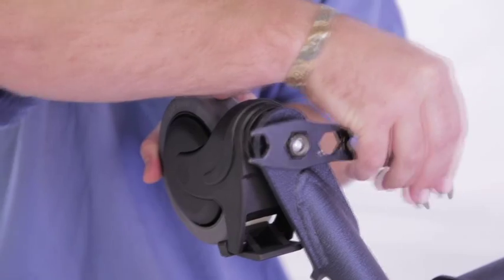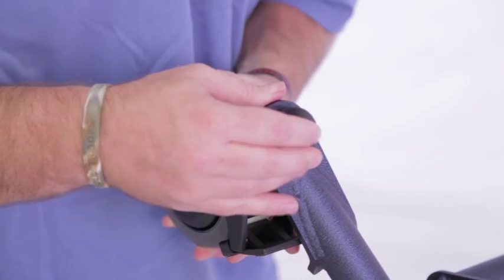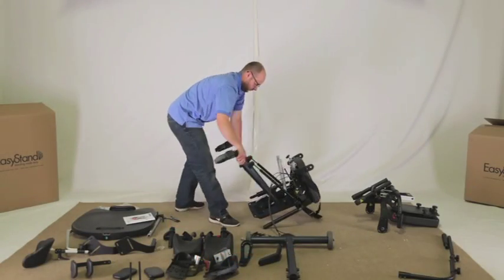Place the black cap onto the unit to cover hardware. Repeat these steps for installation of the other rear caster. Place the unit down as shown.